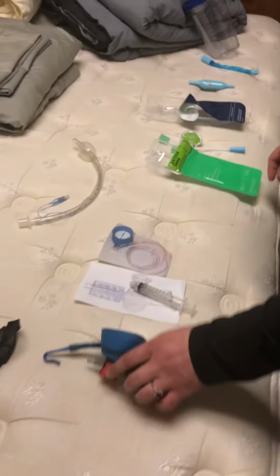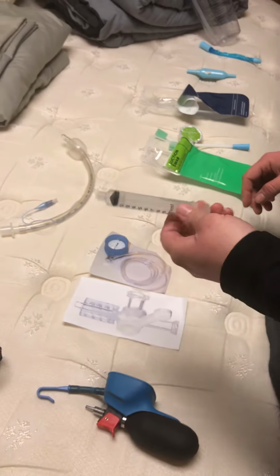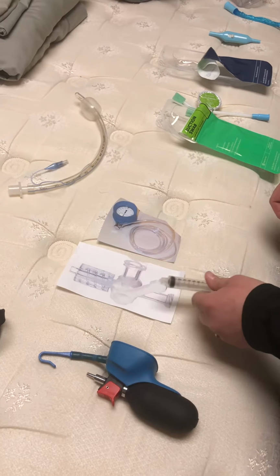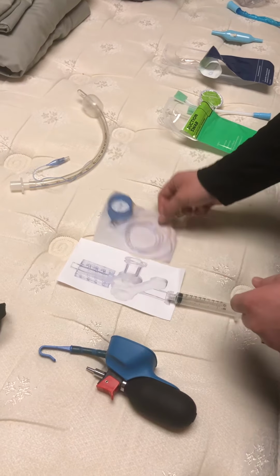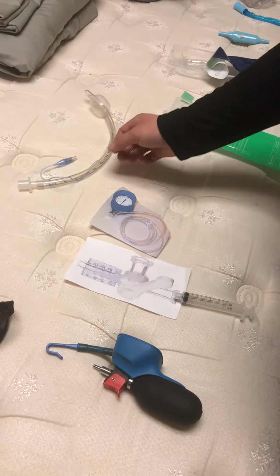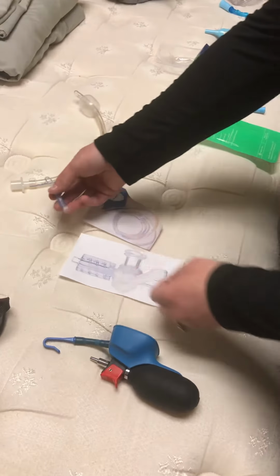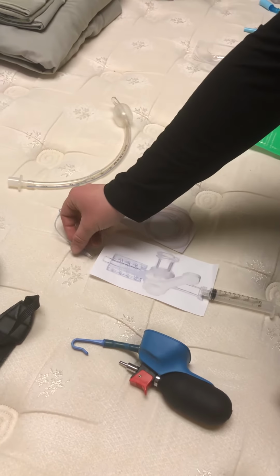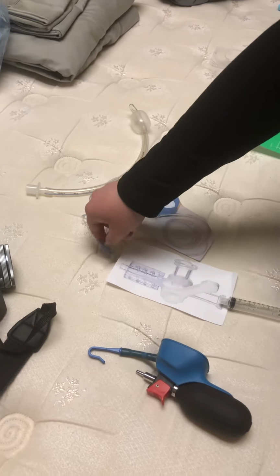So the first thing I'm going to do is get everything set up. So here we have our syringe. We have the 3-way stopcock here. And so we're going to connect your syringe to one side. You're going to have a meter. And then you're going to connect their cuff there, pressure cuff there. And what you're going to do is a 2-way test.